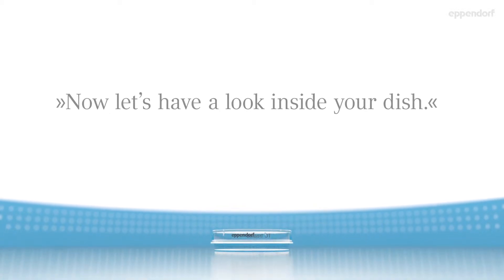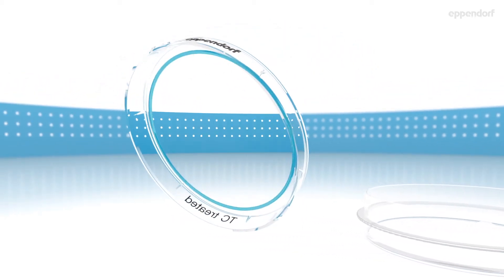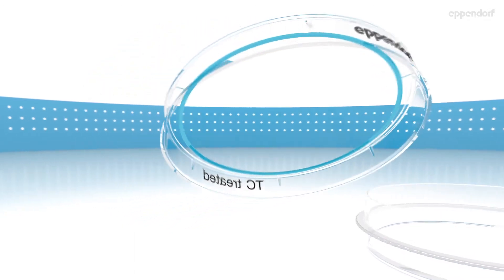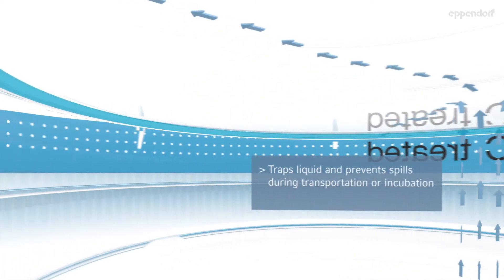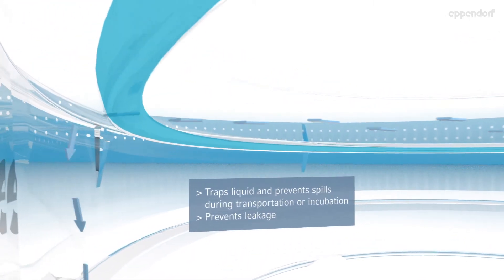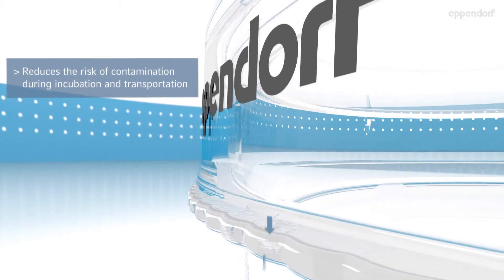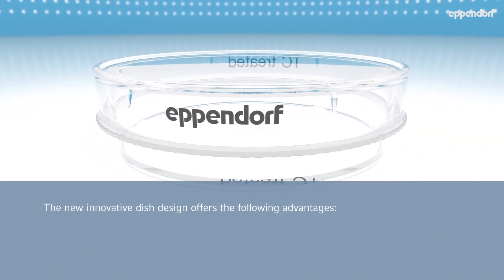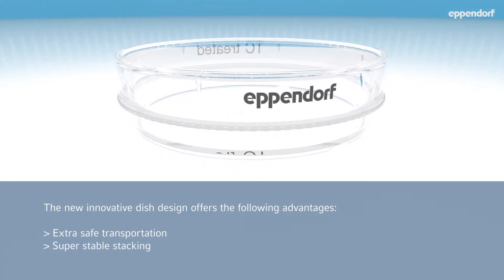Now let's have a look inside your dish. This is your splash protect ring. It traps liquid and prevents spills during transportation or incubation. It prevents leakage and reduces the risk of contamination during incubation and transportation. The new innovative dish design offers: extra safe transportation, super stable stacking, and effective protection against spilling and contamination.